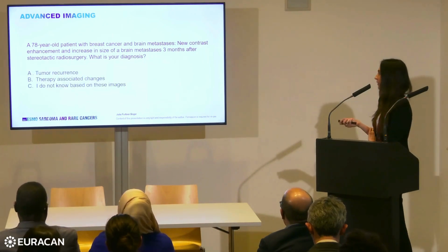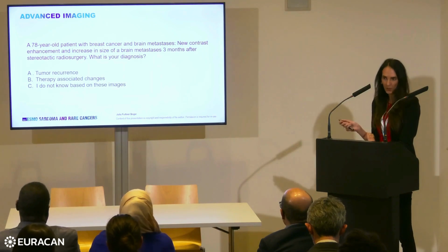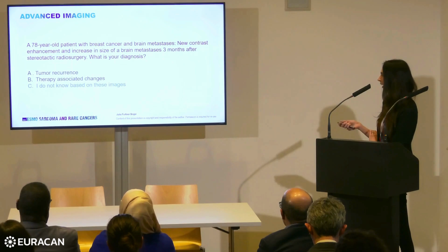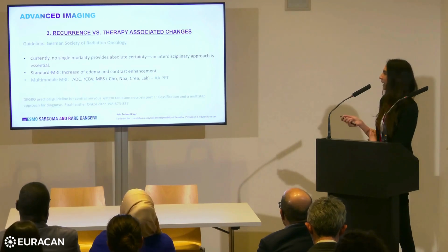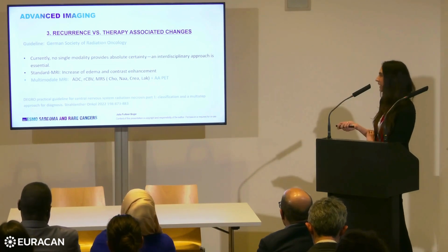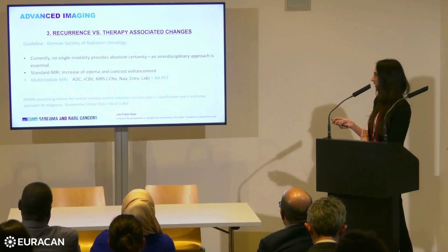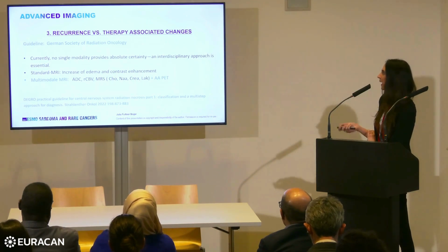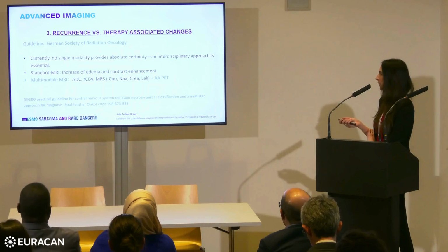My typical answer is, I don't know based on this image, so we have to do further imaging. I'm not ashamed anymore, because there is a guideline from the German Society of Radio-Oncology which says that currently no single modality provides absolute certainty, and this is an interdisciplinary approach.